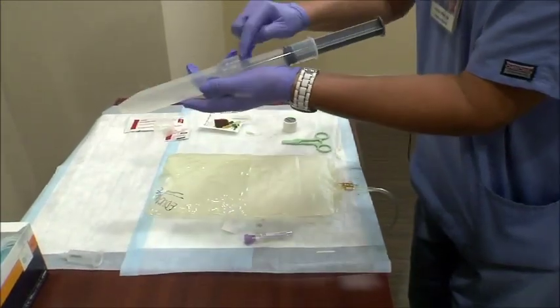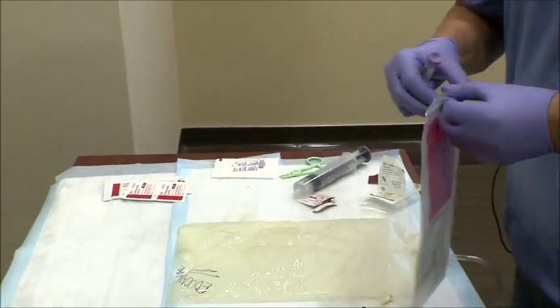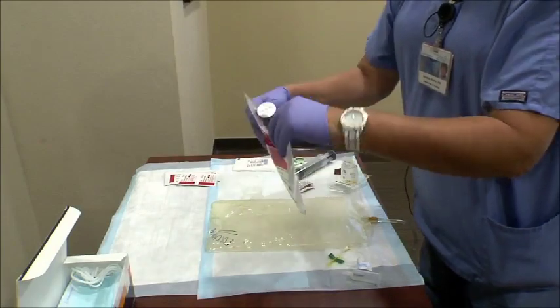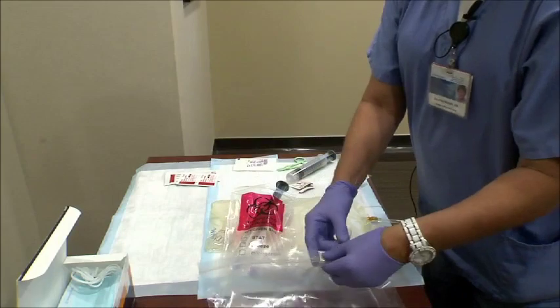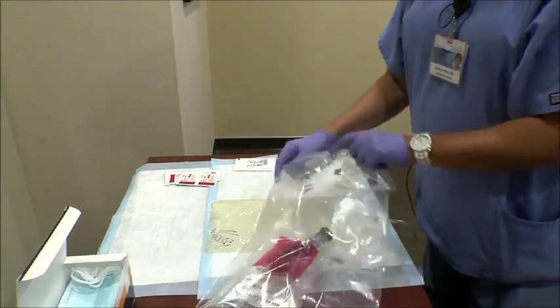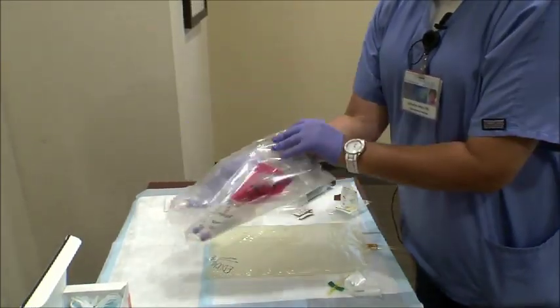We actually put our labels on the syringe itself and on there. We have our biohazard bag. We place this in here. As you can tell, the syringe is too big for the bag, so we suggest to place it inside another clear bag. Seal it up and send it to the lab.